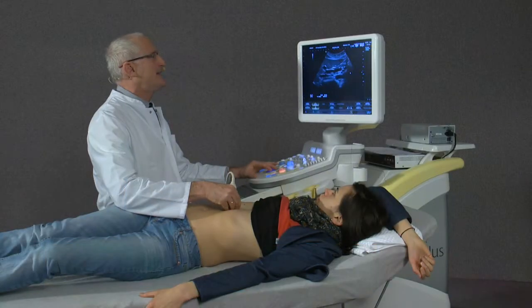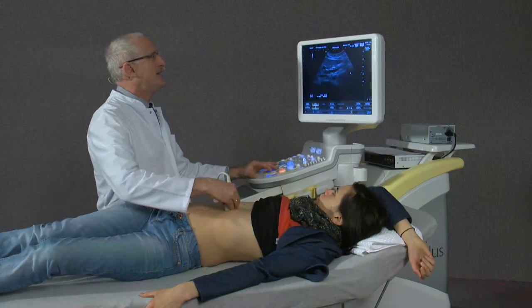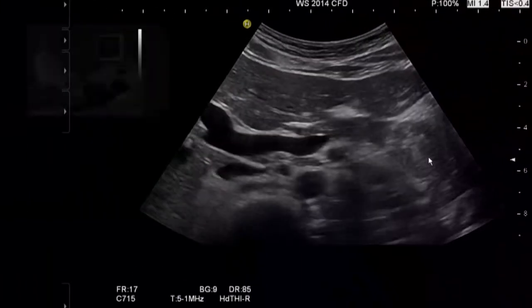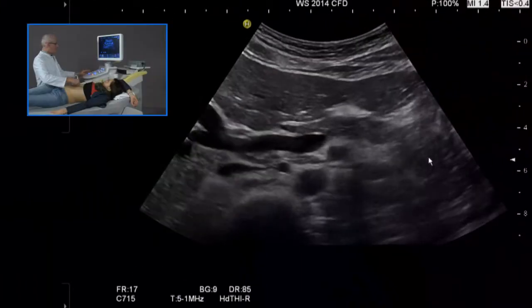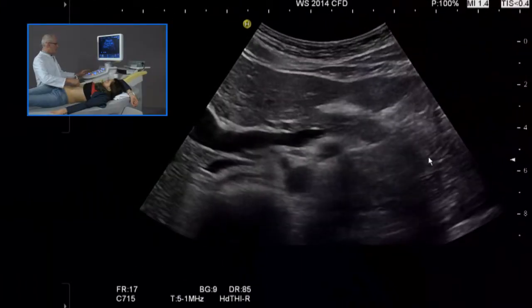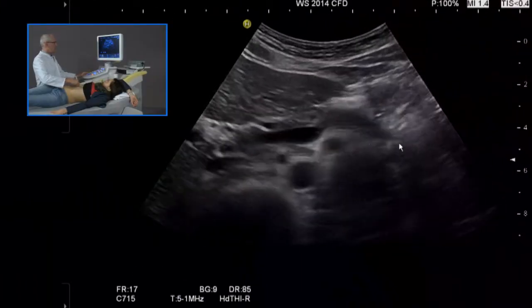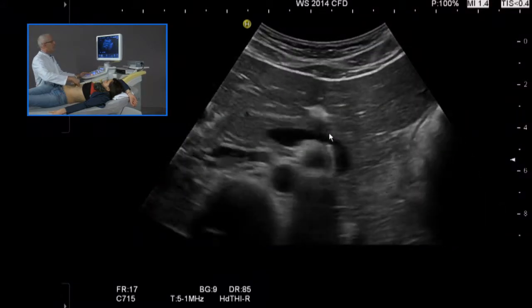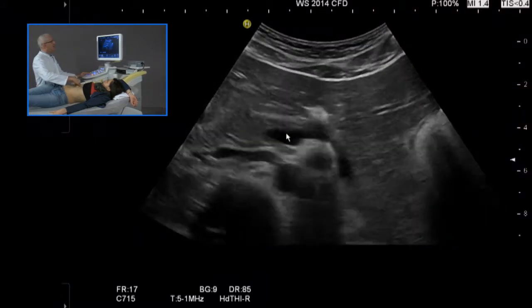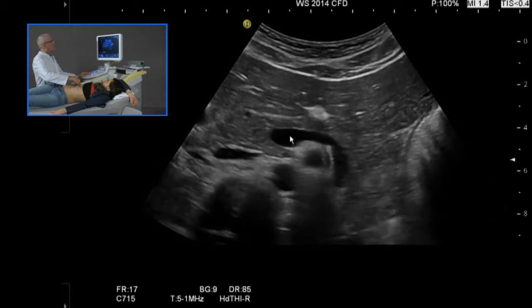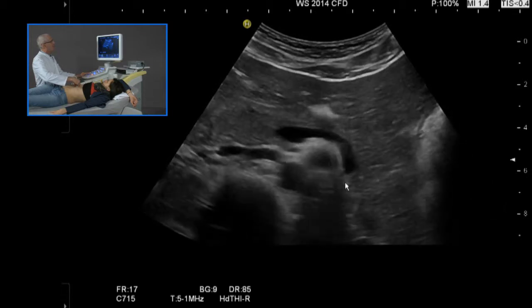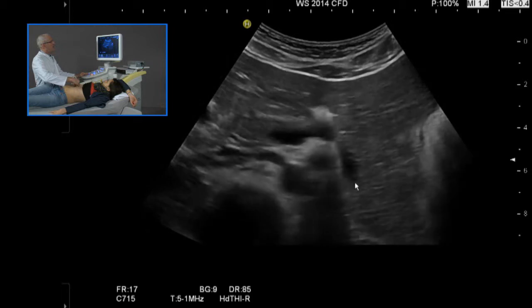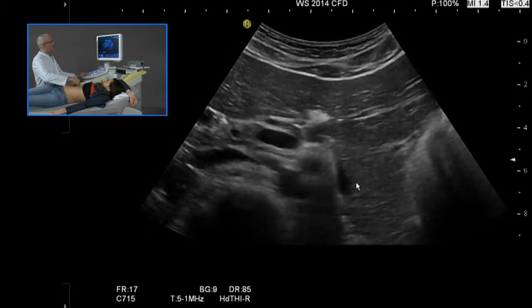The portal vein can be nicely displayed. If we focus to a transversal position of the transducer, we can nicely follow the splenic vein distally up to the level of the left kidney.